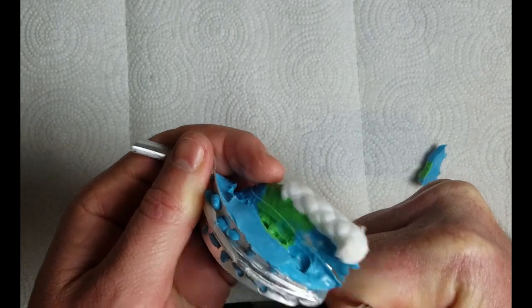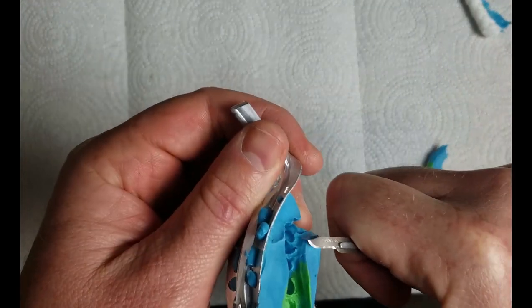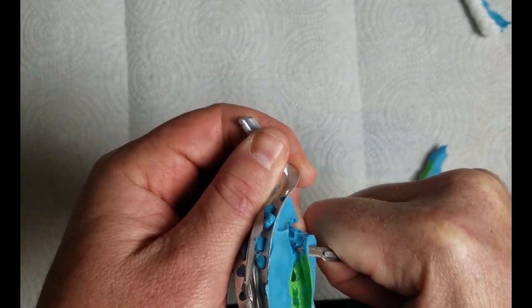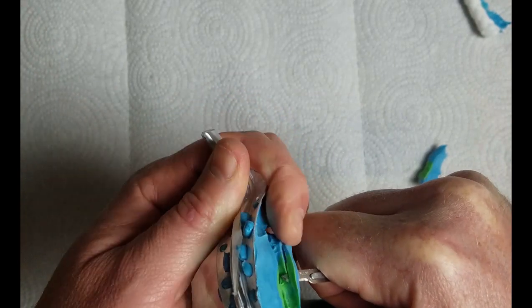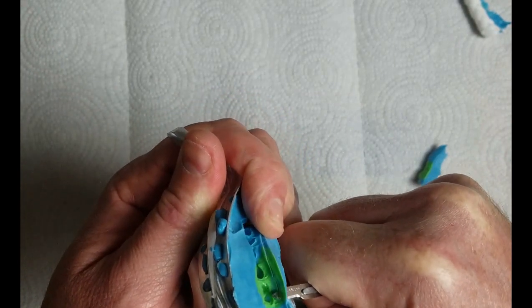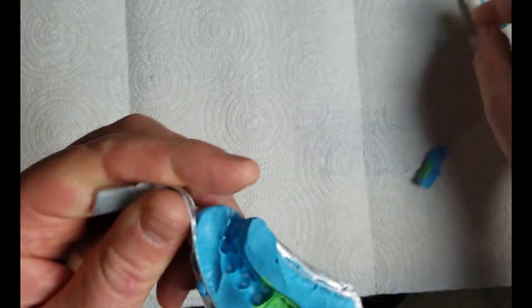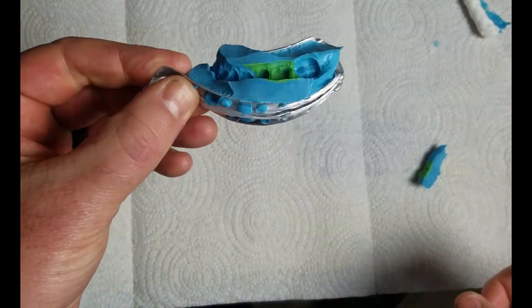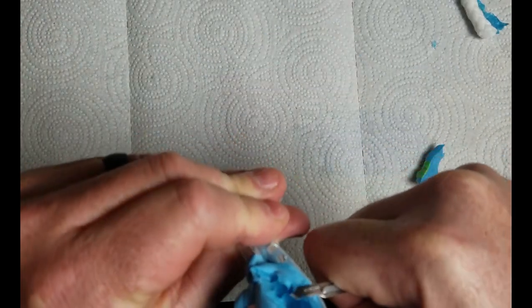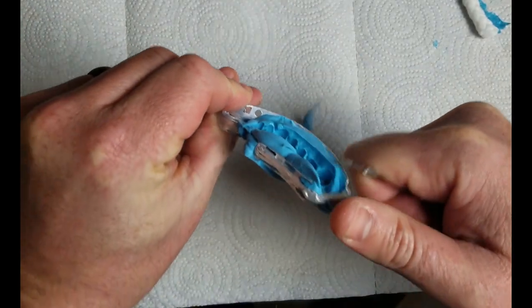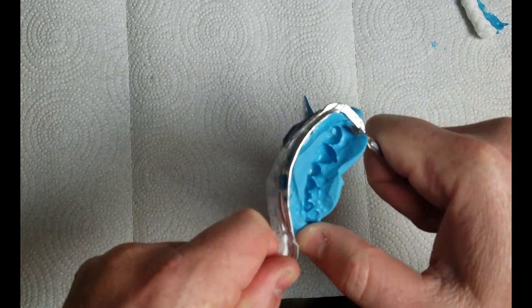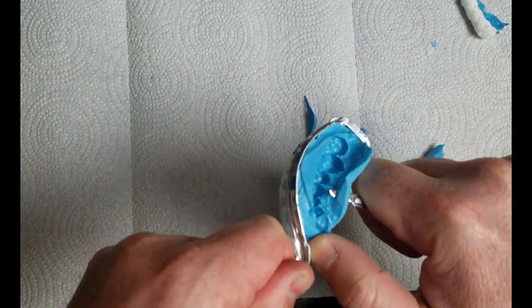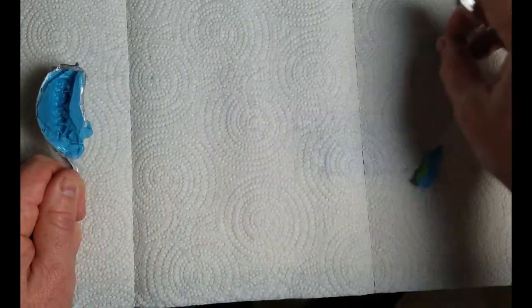This will not contribute to the accuracy of the scan in any way, and by reducing them, it will allow the camera to be able to see more clearly inside of the prep tooth. Do the same for the opposing. And that should do it.